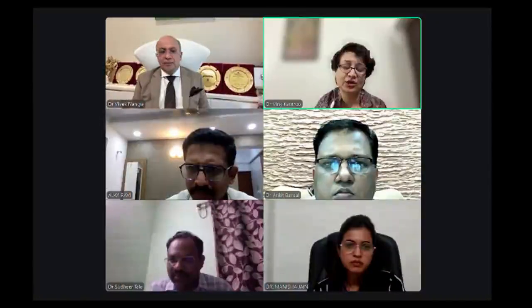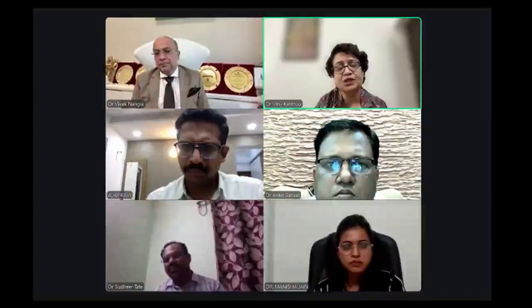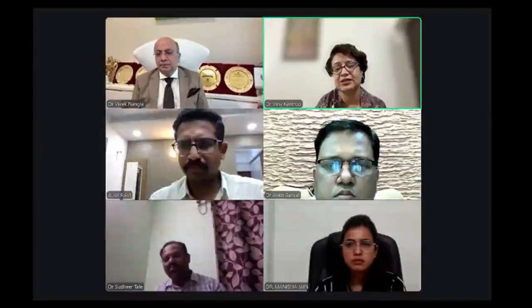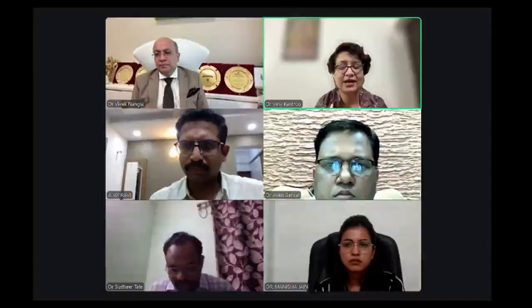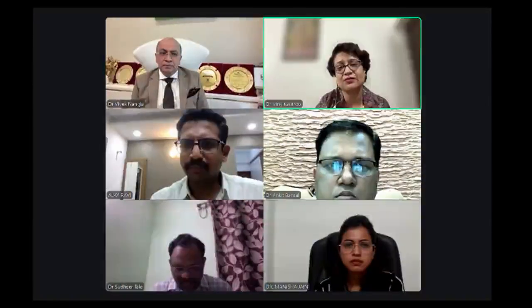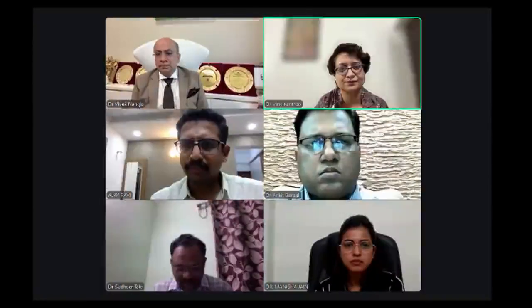For the ones going for histopathology examination, they are to be sent in 10% buffered formalin solution to the histopathology lab. Also, the ones for molecular diagnosis go in the same container, the formalin solution. However, ideally, they are to be frozen in liquid nitrogen. However, this is not present in every center. We also do not have it at our center. We only send the formalin-fixed tissue for molecular analysis as well.